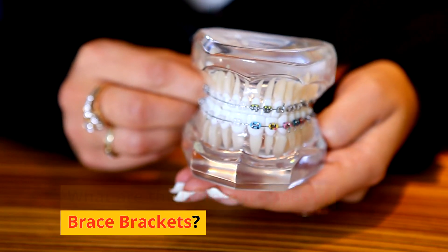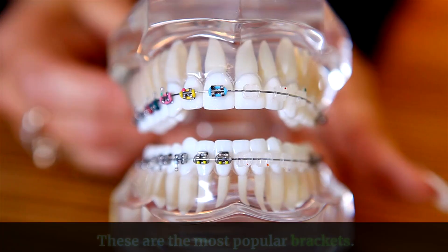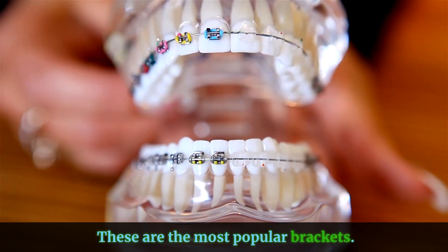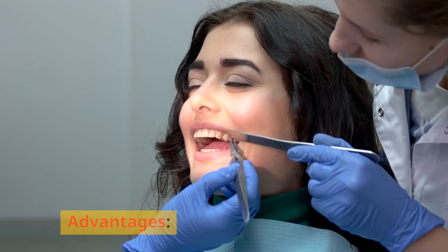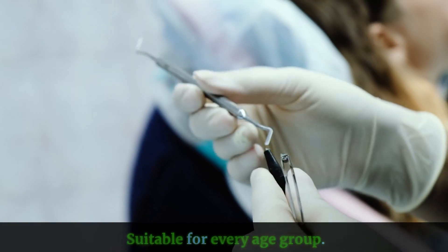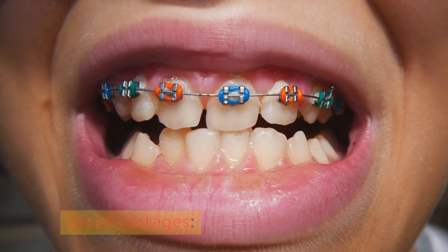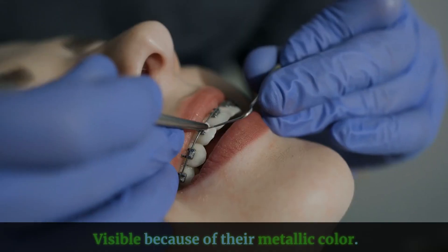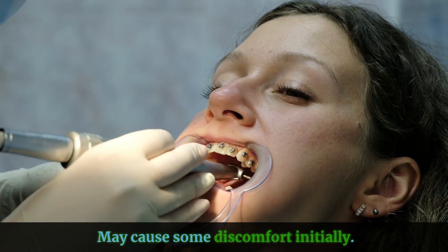Traditional metal brackets are the most popular brackets, crafted from high-quality stainless steel. Advantages: durable and trustworthy, cost-effective, and suitable for every age group. Disadvantages: visible because of their metallic color, and may cause some discomfort initially.